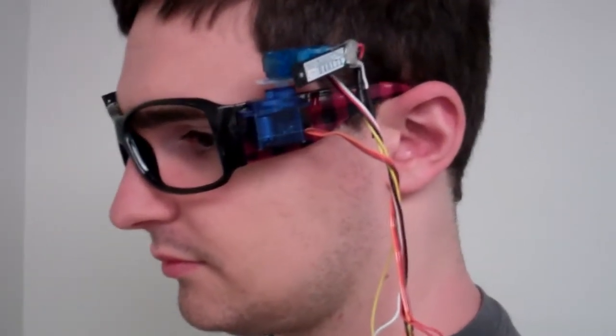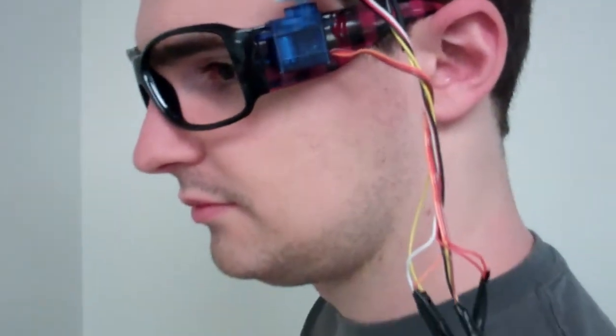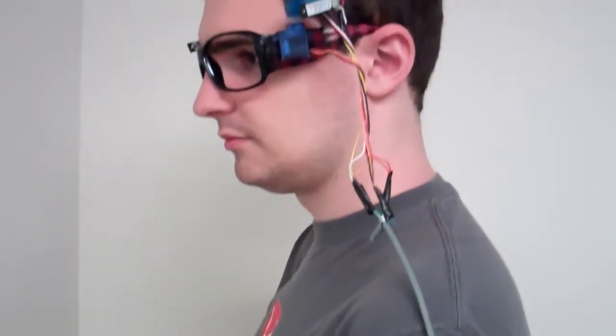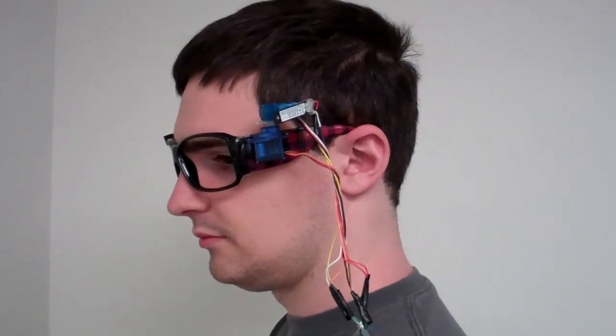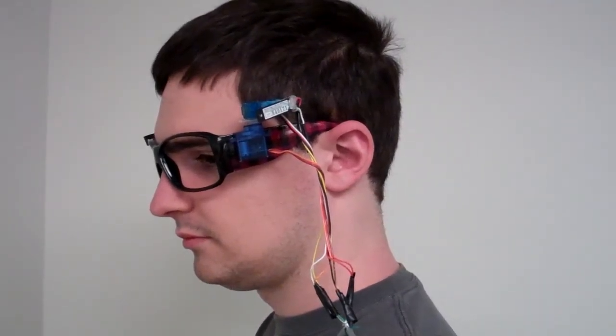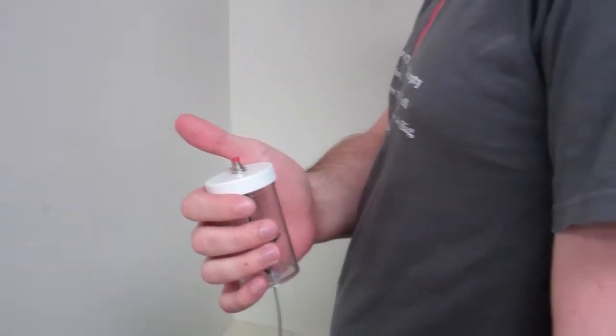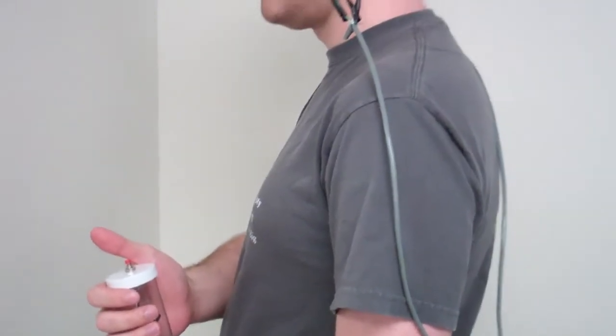These little guys here are the lasers — they're really small. Basically, one of them focuses directly in front of your eye while the other one sweeps a path along whichever axis you're trying to measure. By pressing a connected button, it indicates at what angle you can no longer see it, allowing the device to determine the edges of your peripheral vision and the locations of your blind spots.